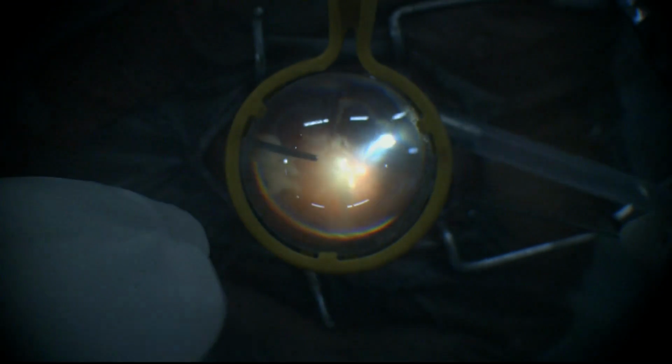अभी कोई ऐसा व्यू में compromise भी नहीं है. I think even the corneal opacity is not bothering us much, which was a big concern for me.